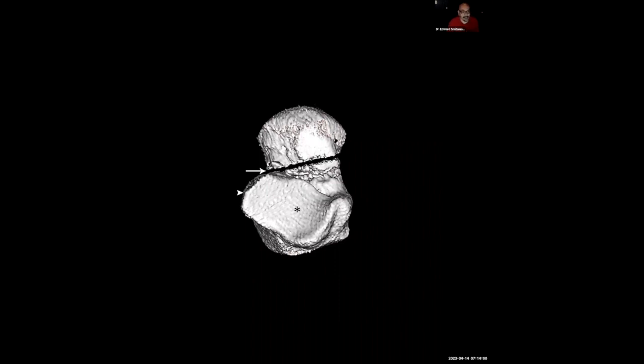They may not stay still. They may not be cooperative for the imaging examination. So the next, probably the best imaging, if available, is going to be non-contrast CT. And the nice thing about CT is, as we all know, we're able to reformat in any plane after we scan the patient in whatever position that they can handle, okay? And that actually provides additional fracture information not seen radiographically in up to about 90% of patients or so, okay?